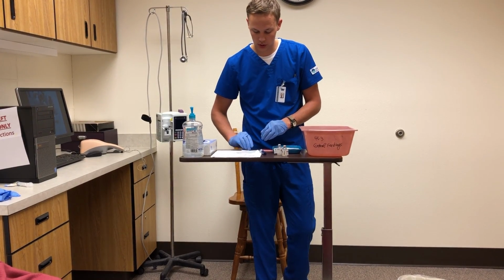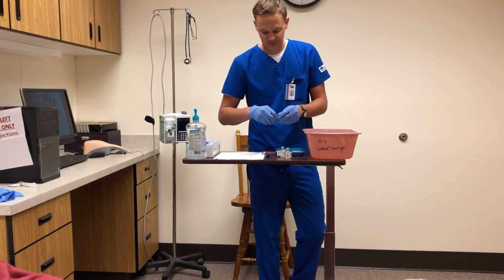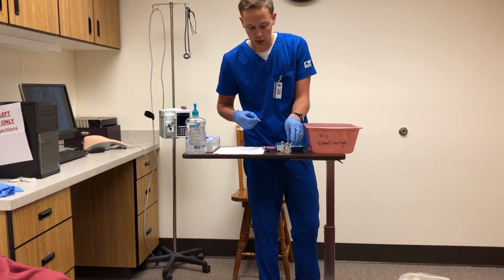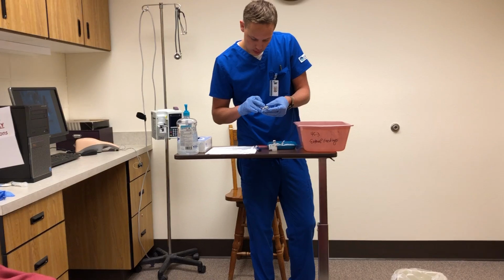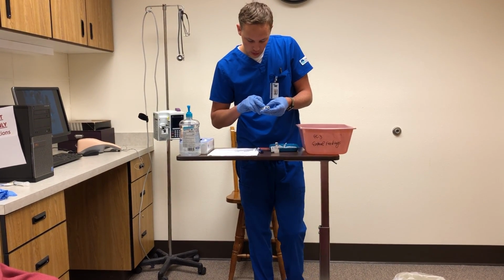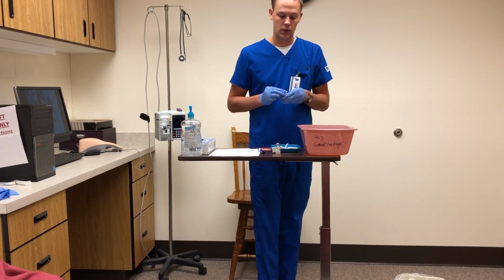Okay, so there's that one. Also go on to wiping down the other one, which is the regular insulin U100. So I'm just going to check it again. Regular insulin U100 for Shirley Coast, female, with the date of birth 5/14/1964, and that all matches. So we'll wipe this one down too.